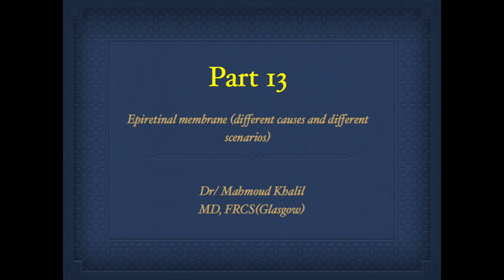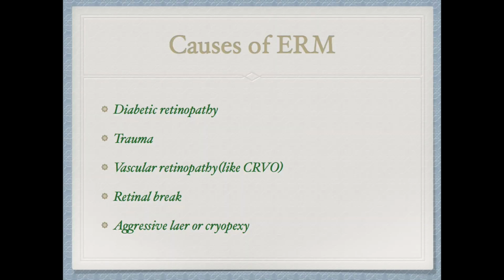Welcome everybody. This is part 13 of step-by-step vitrectomy. Part 13 includes epiretinal membrane, different causes and different scenarios. Different causes of epiretinal membrane.